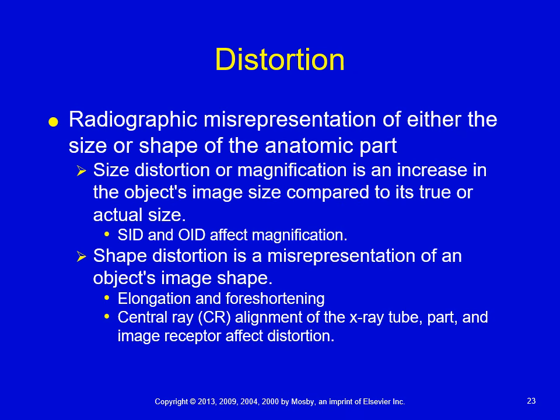All right, so with that angulation on the tube, you compared your baseline regular chest X-ray to the second image where you gave it an angle that was intentional, but it's not supposed to be there because that's not what we are looking for. And what you should have seen with the new chest is that it looked different from the chest that we would get for diagnostic purposes. It threw some of the anatomy longer, flatter. It threw maybe the clavicles out to where they didn't need to go. So that's what we're talking about in terms of shape distortion.